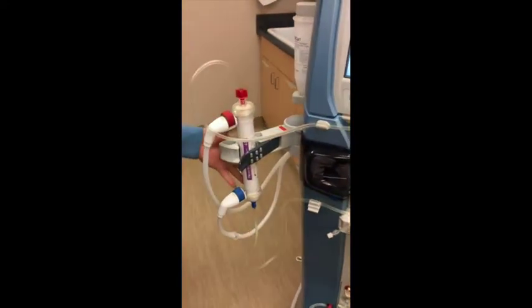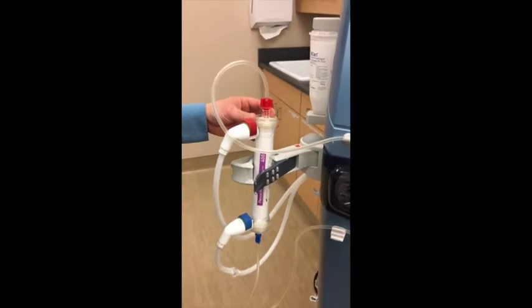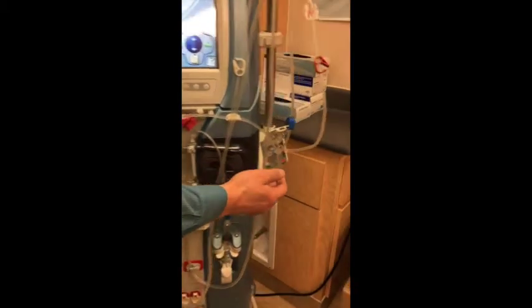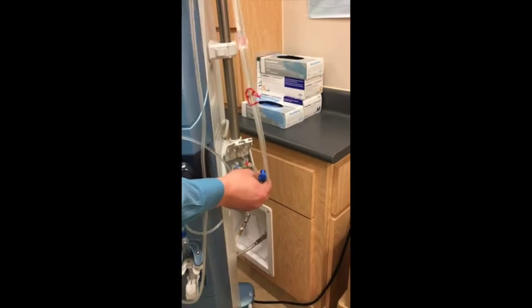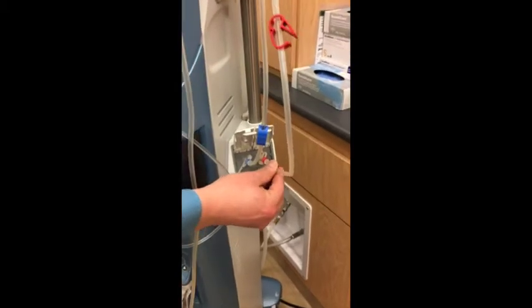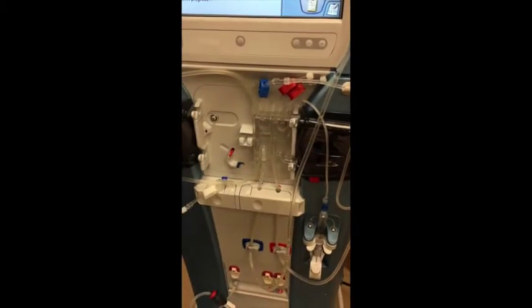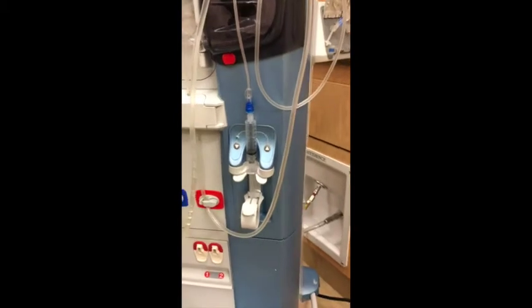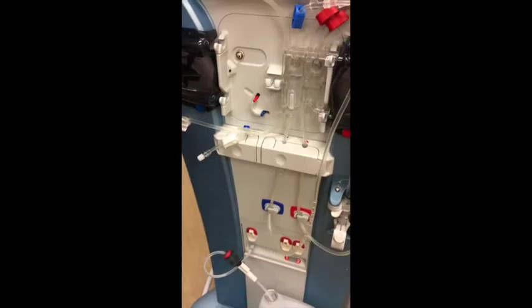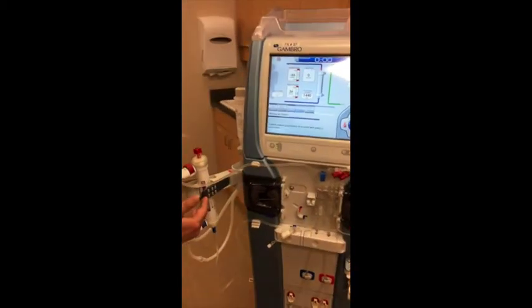This is the dialyzer, the artificial kidney. It is in here that the actual exchange of fluid and electrolytes — the cleaning of the blood — occurs. It's connected through tubing that is driven by a pump here, which pulls blood. This line is temporarily connected to the machine for priming, but these two lines will be connected to the patient, pulling blood from the patient and returning it. We prevent clotting by the infusion of heparin, and we monitor with pressure for leakage. We have clamps and pump stops for safety, and alarms to ensure the patient's safety.